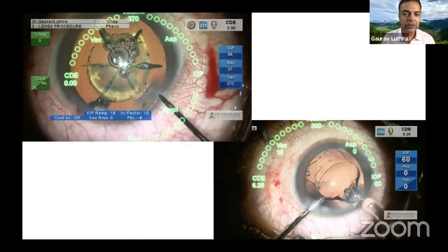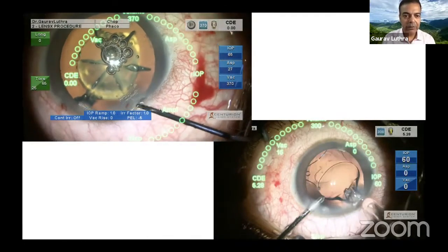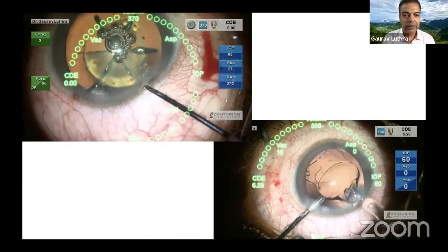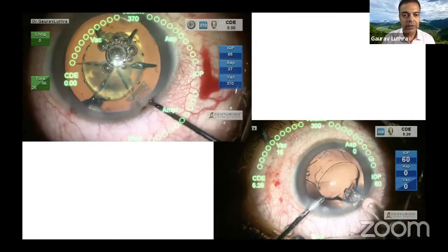Another small situation where I have a good looking incision and I think I'm happy about it, I'm going to do well, but I'm now dissecting the vertical part of the incision, the first plane, and then I get into the second plane.